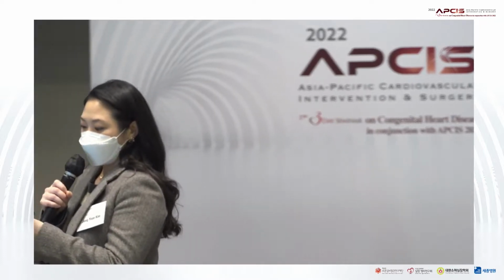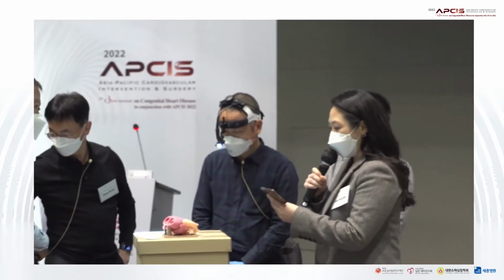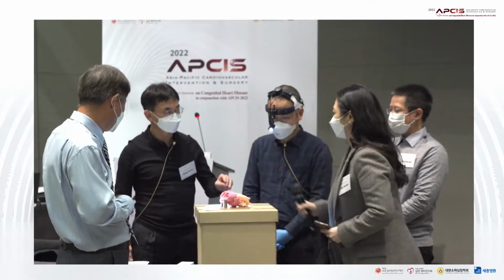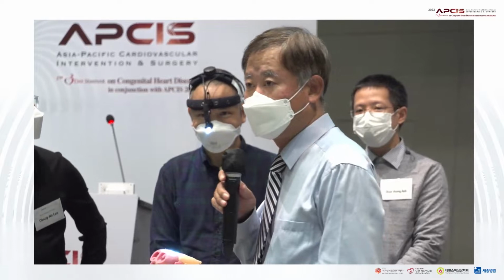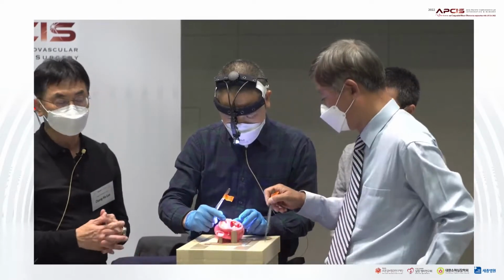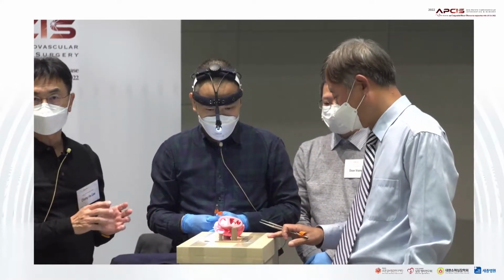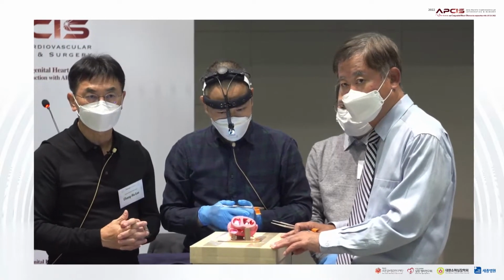So, as part of this program, I would like to invite Professor Tae-Gook Chun and Chang-Ha Lee to explain what you would like to do today. As a young surgeon, it's very difficult to have a chance to do the Senning operation. Maybe today evening is a great chance to practice the Senning procedure. So actually today we are going to do the anatomic repair using this cc-TGA model.